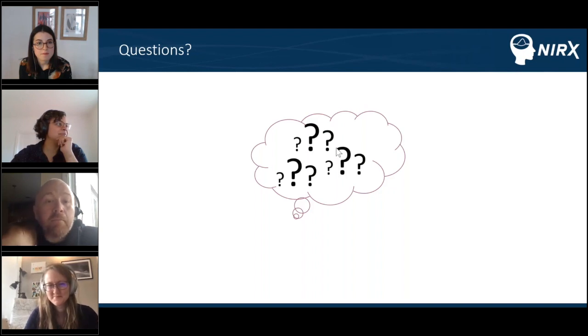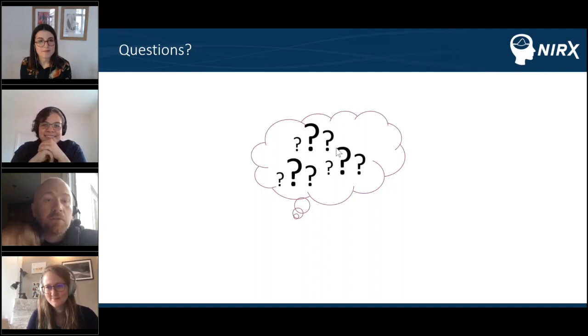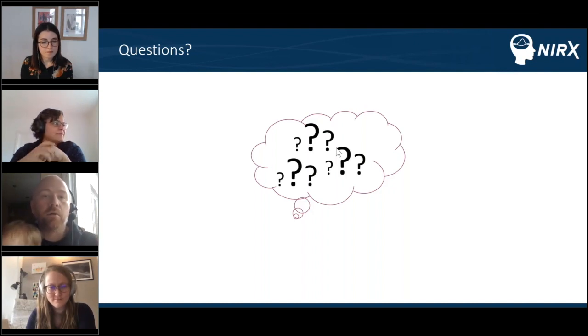My toolbox is able to read and write the SNIRF format, just like Homer3. My toolbox also includes converters. So if you have .nirs, NIRx or Hitachi or whatever, you can read it into my toolbox and then save it back to SNIRF format. Then you can import it to Homer3 if you wanted to go that route. We're trying to make the data formats work both between Homer3 and my toolbox, based on SNIRF.